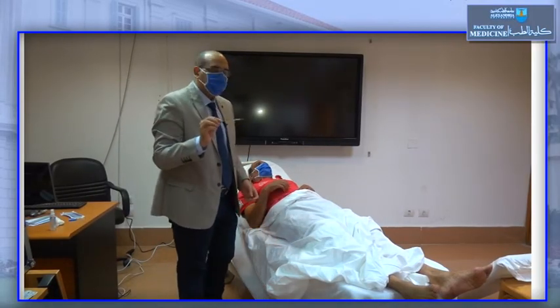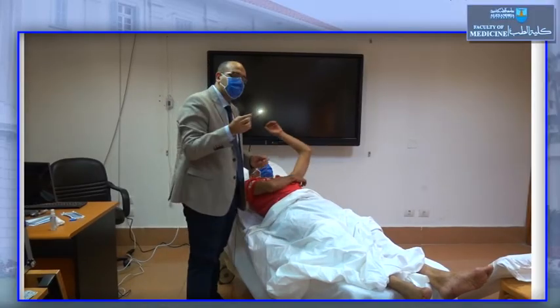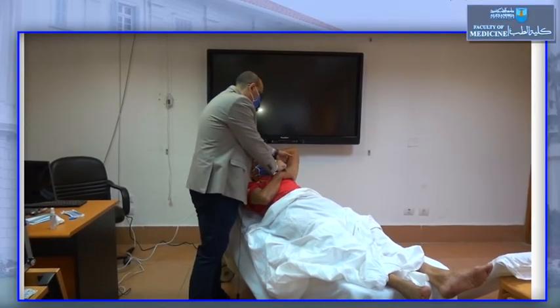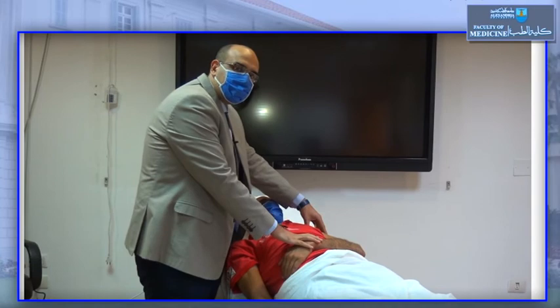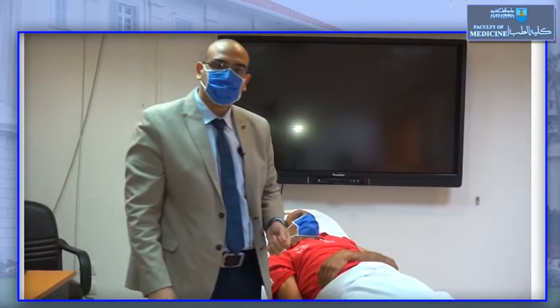either we are going to measure it axillary or oral. We will use the axillary method. The axilla of the patient should be dry and clean. We put it in the axilla and close it, and the patient's arm will be flexed on his chest. And we should wait for 3 minutes.